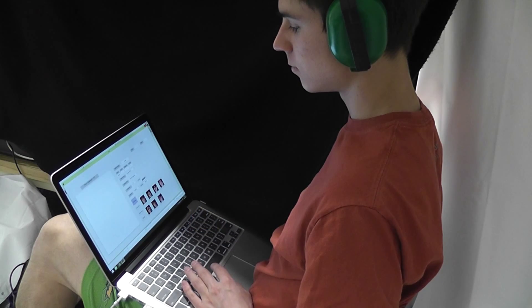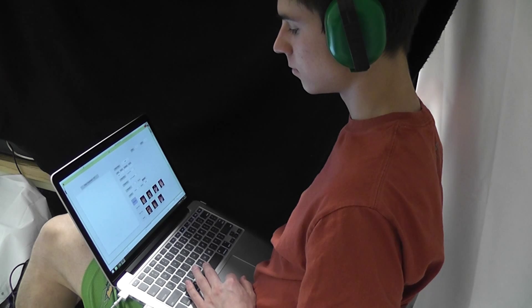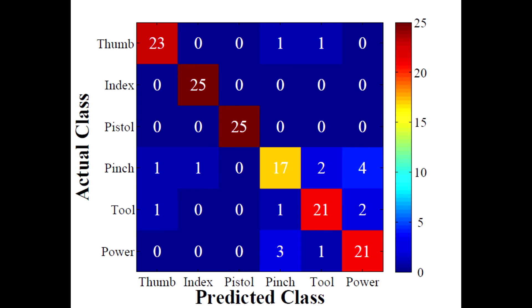After a brief six-minute training session, the prosthesis is hidden to the user, and the six grips were presented to him five times each in random order. On average, subjects were able to correctly classify the grips with 88% accuracy.